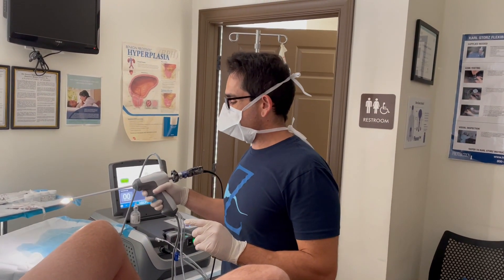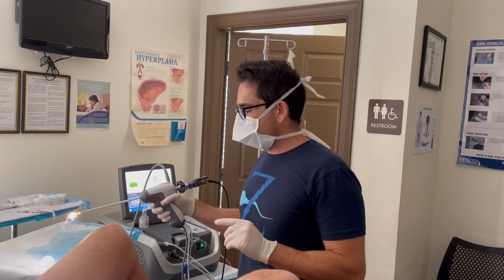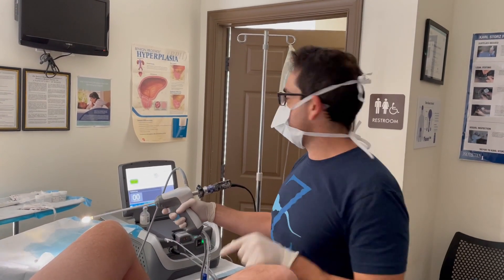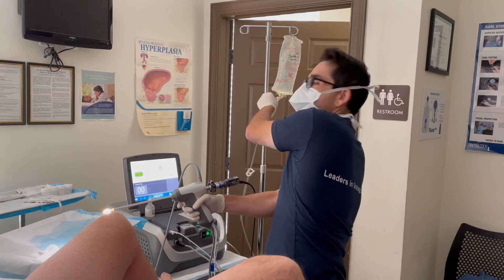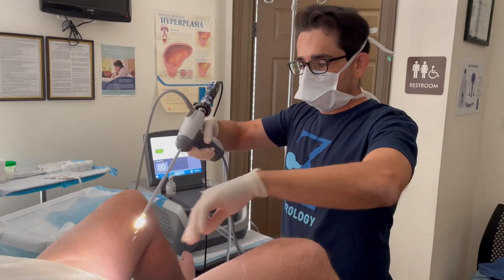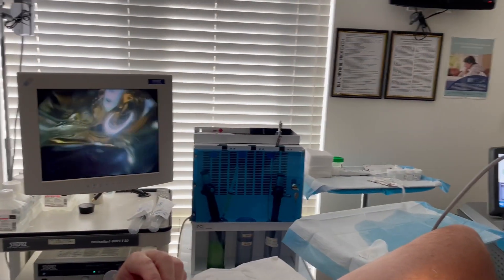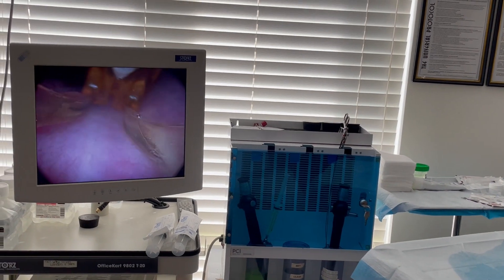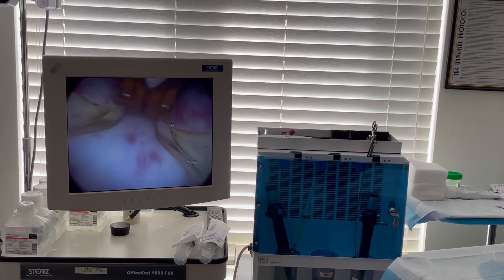Hey guys, it's Dr. Mike here. We're about to do the Rezoum. In order to be efficient, my team has everything set up. We've given a local block, he's on his nitrous, and we filled the chamber with no air bubbles so we have the best imaging we can. His prostate should be a good one for this — it's less than 40 grams — so let's get started and see how we do.